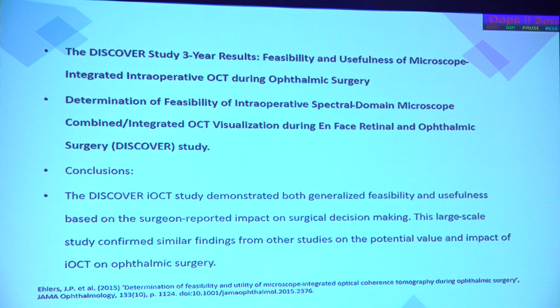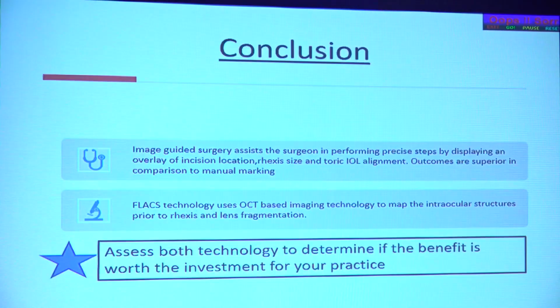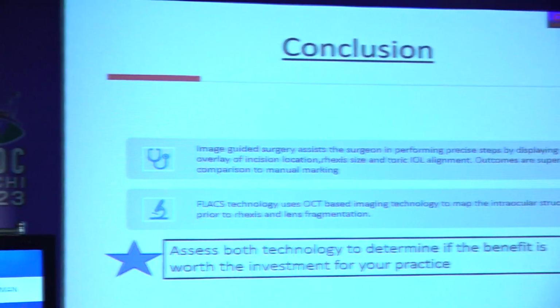Again, this is another one which said intraoperative OCT for VR surgeons. It confirmed the feasibility of it and ensured that the patients had a better outcome. So again, this is for VR surgeons. And also, if you are a cornea surgeon, this also helps you to do penetrating keratoplasties. You can have a better confirmation that the graft and host junction are well adhered. Lamellar keratoplasties, to ensure that the lamella is well attached to the cornea. All can be seen by intraop OCT as well.